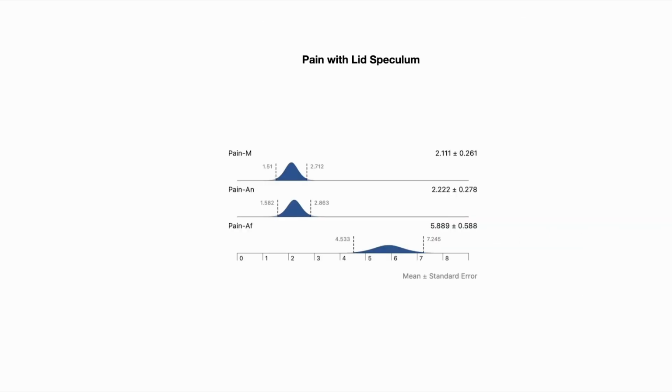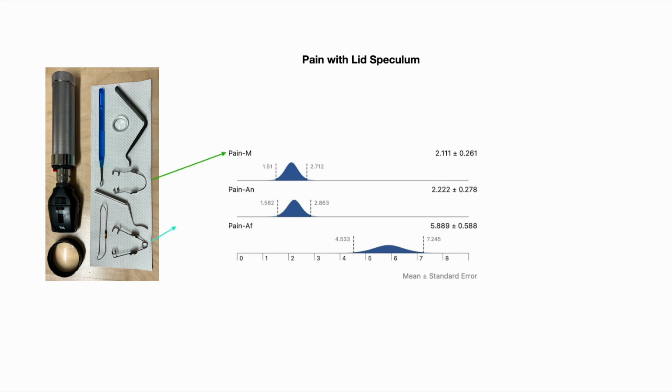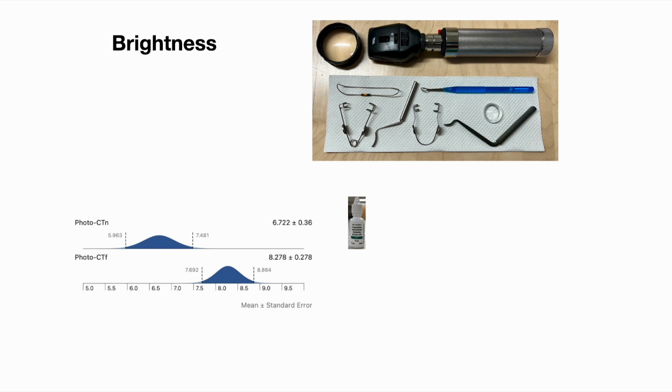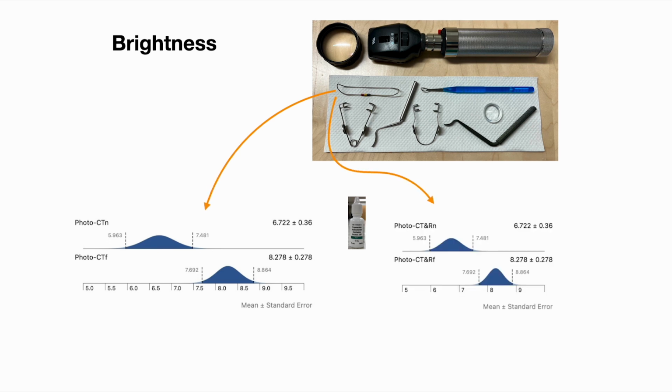As far as pain with lid speculum, the Moria and the Alfonso with topical anesthesia had similar amount of pain, but when we did not use topical anesthesia, there was increased pain. As far as brightness, the see-through scleral depressor appeared to have increased sensation of brightness when the patient was feeling. This is also true when we combine the see-through scleral depressor with the Runge scleral depressor. There was more brightness sensed without topical anesthesia.